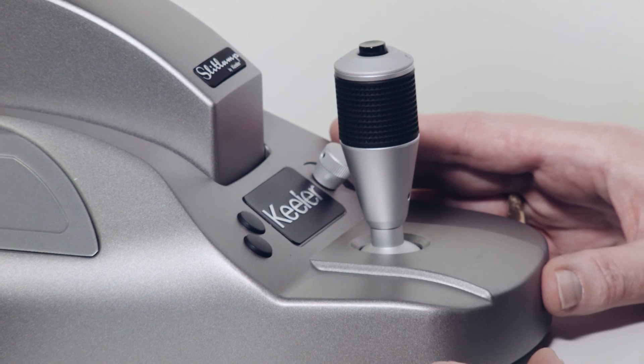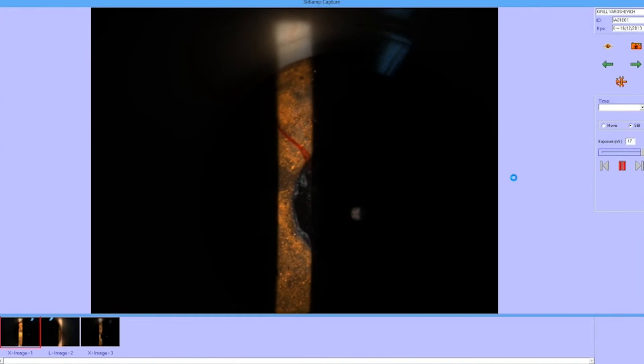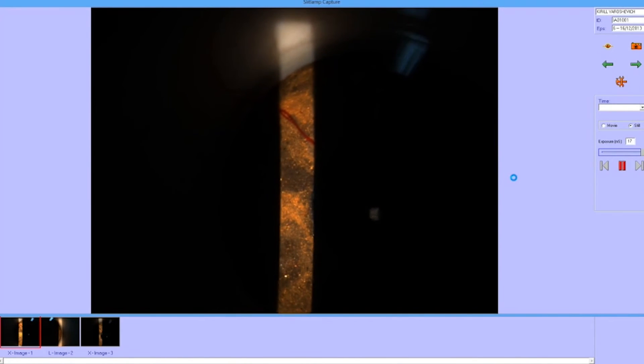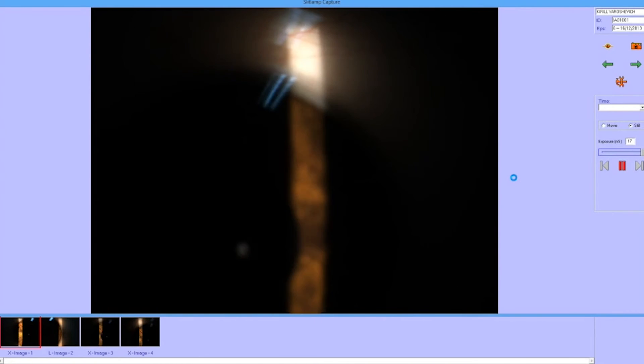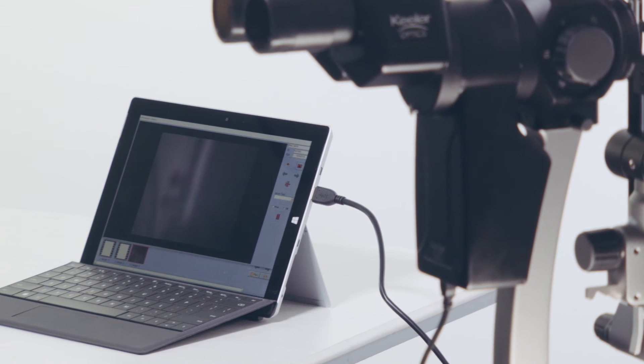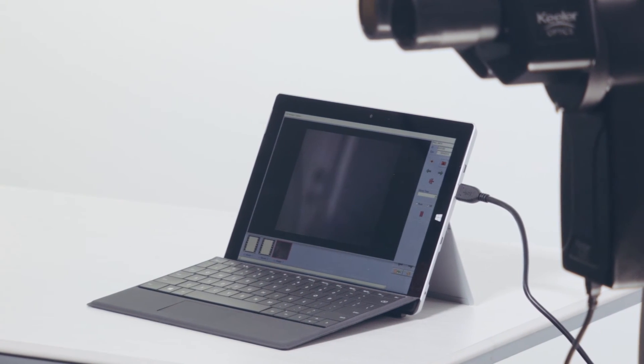Capture an image by pressing the button in the center of the joystick once to freeze frame. Use image review to select the best frame and press the capture button again to capture the selected frame. There are keyboard shortcuts that can be used to quickly adjust digital settings.